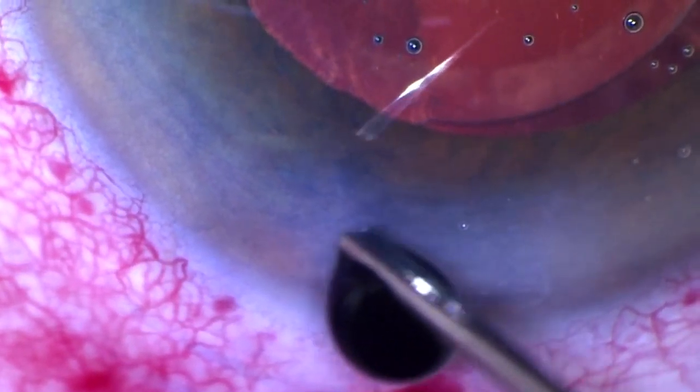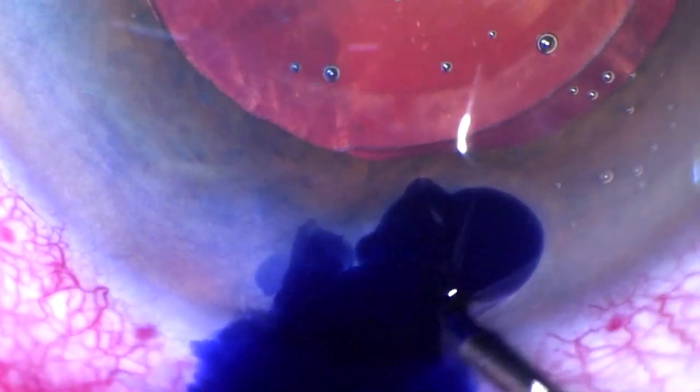With the availability of newer premium IOLs, these concerns also deal with the impact of cataract incisions on the optical quality of the eye. Therefore, well-made and well-placed incisions should allow for effective and comfortable phacoemulsification. They should be self-sealing and should induce minimal astigmatism.